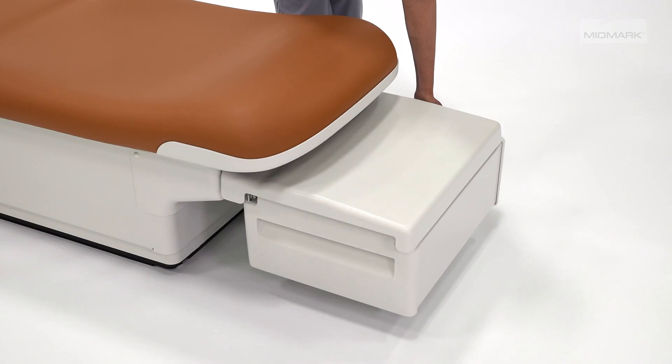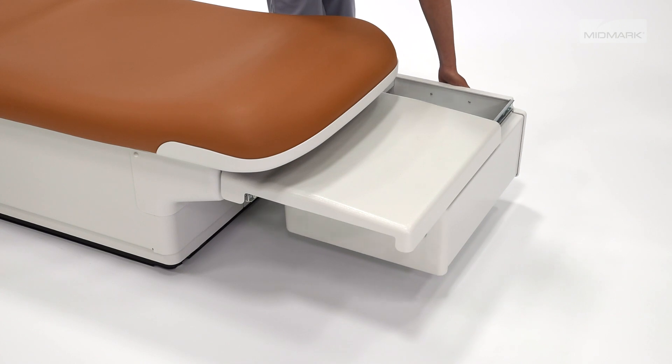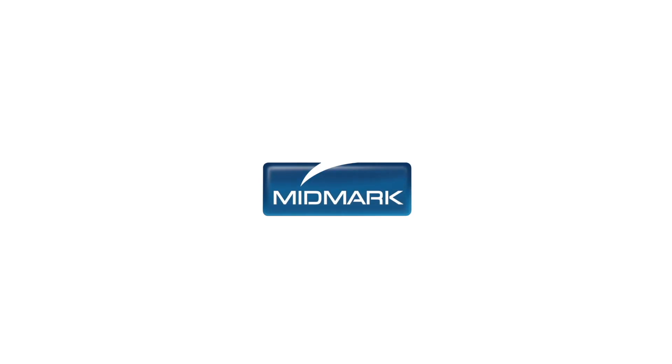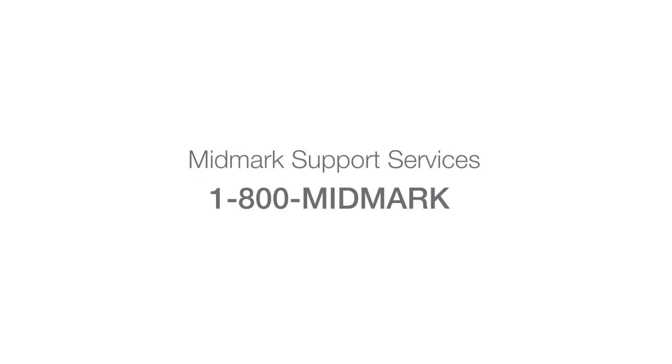The drawer slides in both directions, offering supply access from either side of the chair. For more information about accessories to enhance your barrier-free exam chair, contact Midmark Support Services at 1-800-MIDMARK.